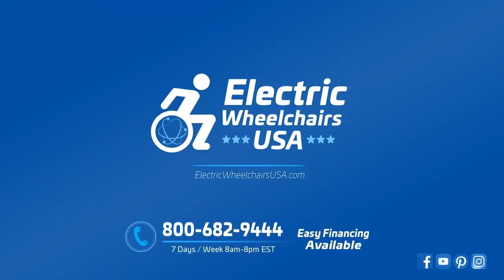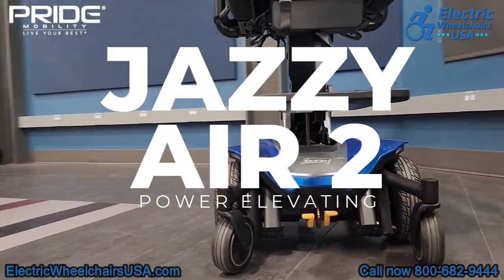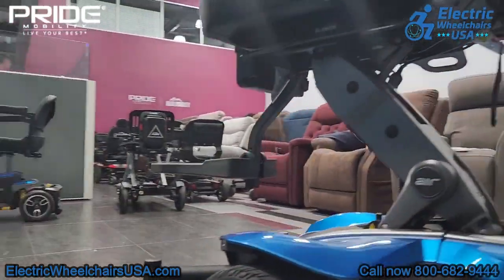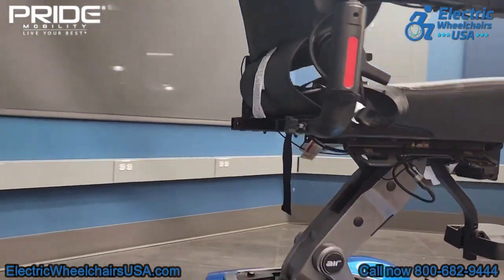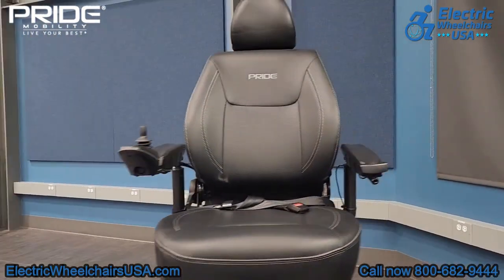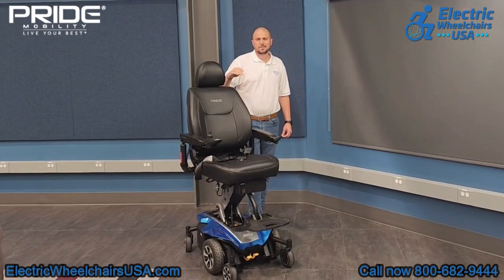Welcome to the Electric Wheelchairs USA Mobility Experts Channel. In this video, we're going to talk about the Pride Jazzy Air 2. This is a power wheelchair with a power elevating seat. It can raise up to 12 inches in height in just 11 seconds. It offers a 300 pound weight capacity and the battery range is just under 20 miles per charge. This is a really great chair — one of the best power elevating seat chairs in the industry.